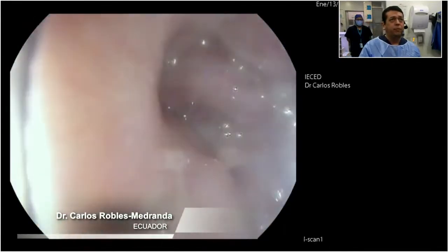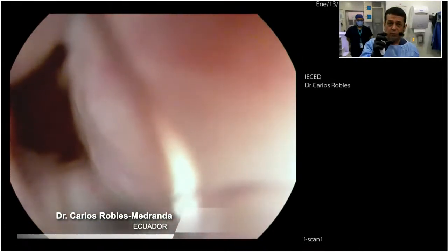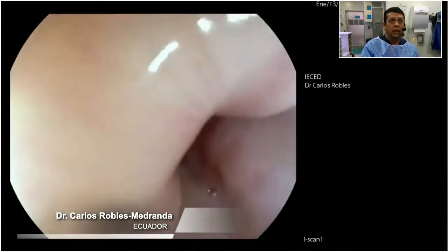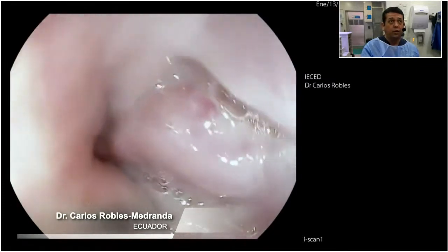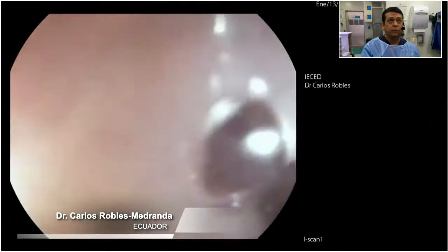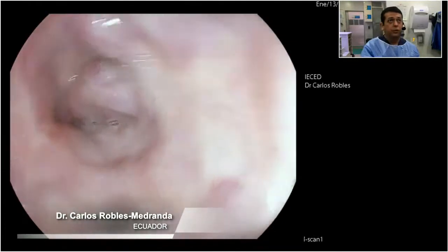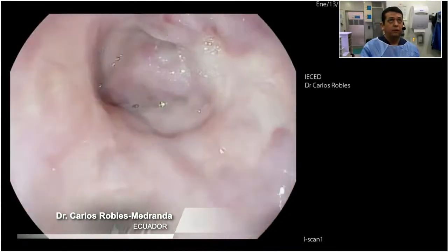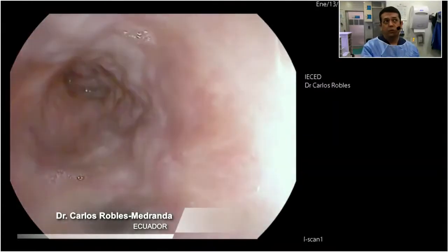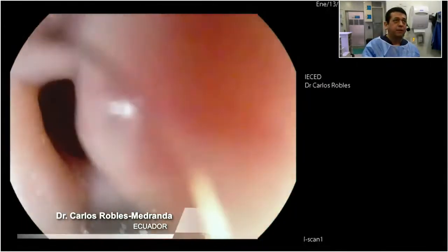So what is very important is always that the rubbers need to be very good, because sometimes it's difficult, and if the rubber is not good and doesn't have good pressure, it can misdeliver, and bleeding could appear during the procedure. Sometimes we can have difficult situations in patients who have been treated for years, as this patient, with the scars. So sometimes the esophageal epithelium becomes very hard to treat. In those cases, you have other alternatives you can see in our YouTube channel. But today, I believe there are no issues with this patient.